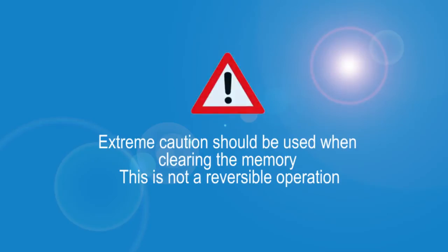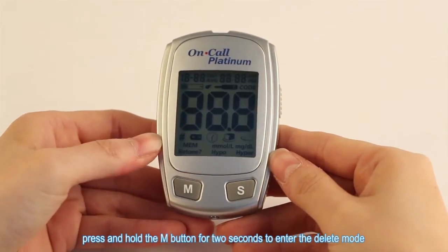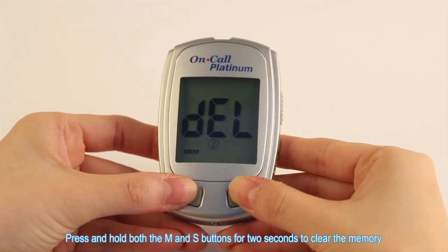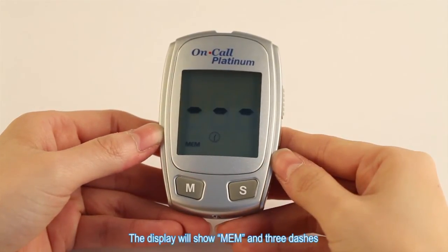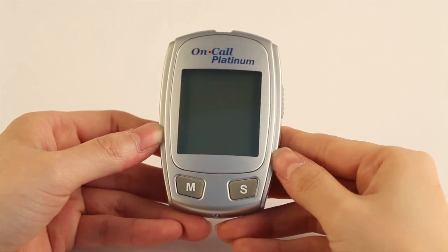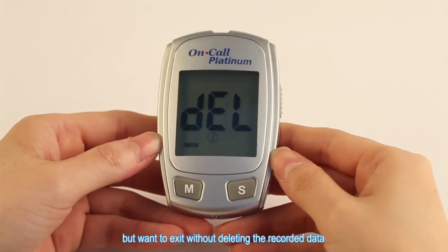Clearing the memory. Extreme caution should be used when clearing the memory, as this is not a reversible operation. With the meter off, press and hold the M button for 2 seconds to enter the delete mode. Press and hold both the M and S buttons for 2 seconds to clear the memory. The display will show MEM and 3 dashes. The meter will clear its memory and turn itself off after a moment. If you entered the delete mode but want to exit without deleting the recorded data, press the S button to turn the meter off.